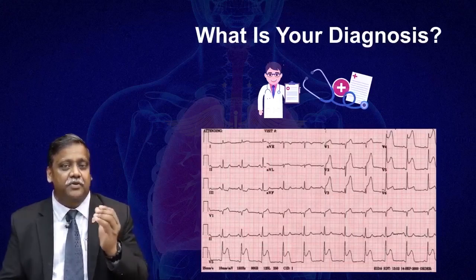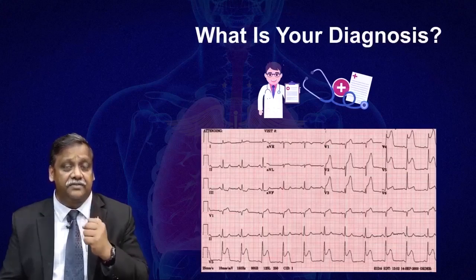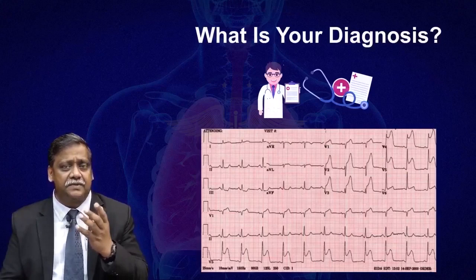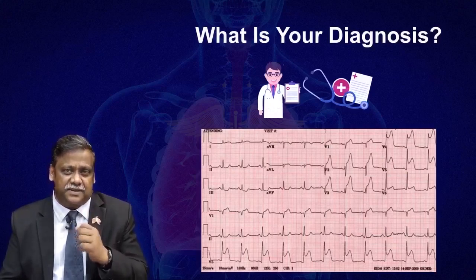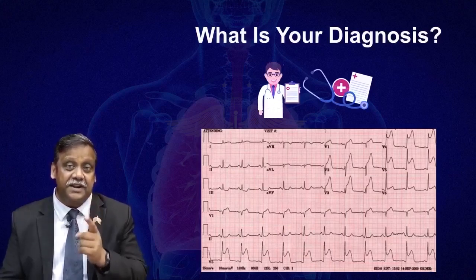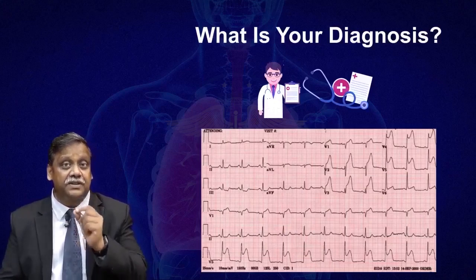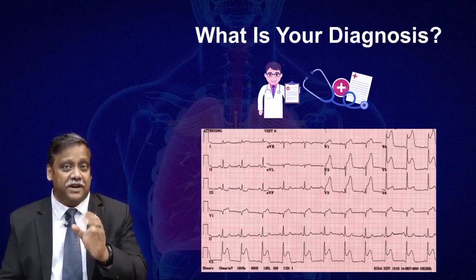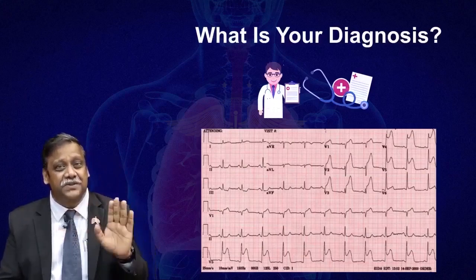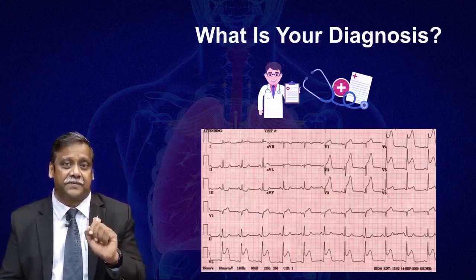But when you were taught how to interpret an electrocardiogram, I am sure you were taught to look at 20 different parameters. So how did you look at all those 20 parameters in 3 seconds? Difficult, isn't it? But still you are so confident that this patient has an anterior wall myocardial infarction. You did that because you looked at the shape of those curves, and you're confident that if you see that ST segment elevation, the T wave inversion, you know for sure that this is a patient with myocardial infarction.